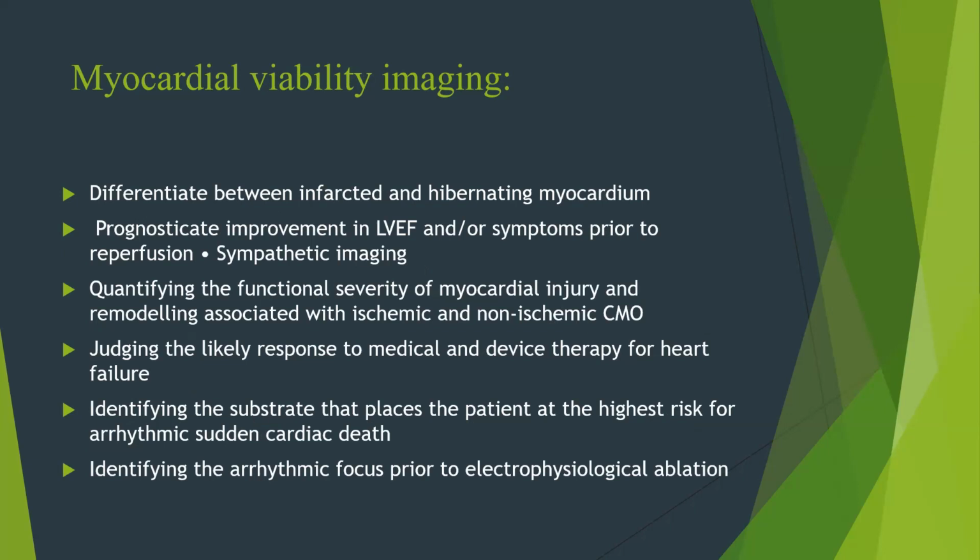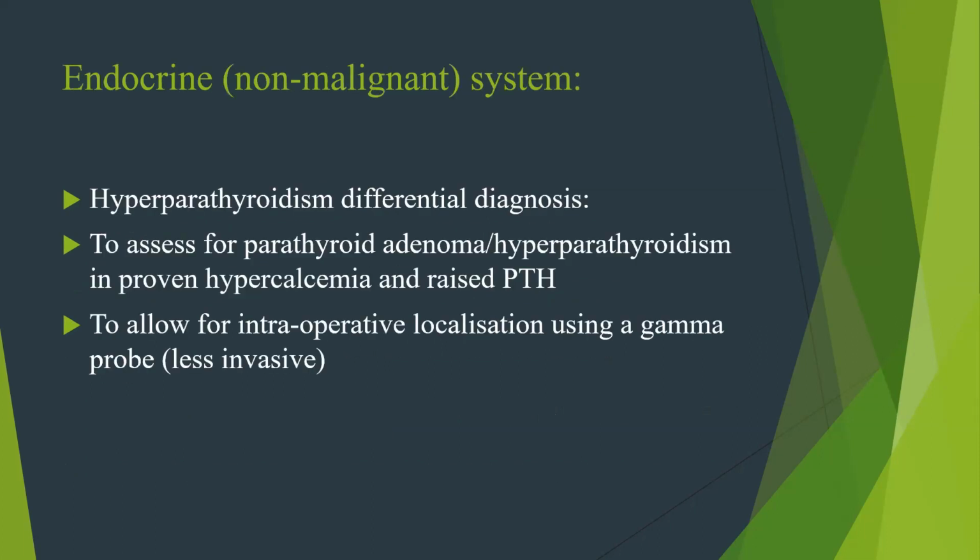We can quantify the functional severity of myocardial injury and remodeling associated with ischemic and non-ischemic cardiomyopathy, judging the likely response to medical and device therapy for heart failure, identifying the substrate that places the patient at highest risk for arrhythmic sudden cardiac deaths, identifying the arrhythmic focus prior to any electrophysiological ablation.